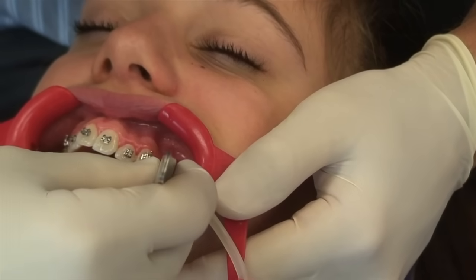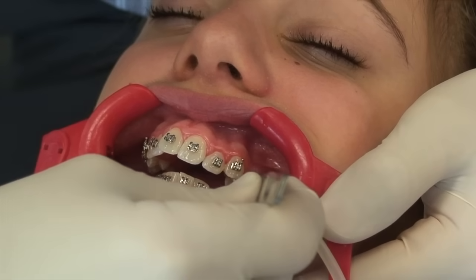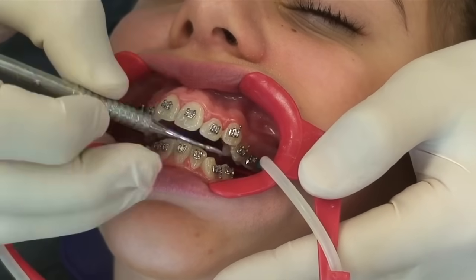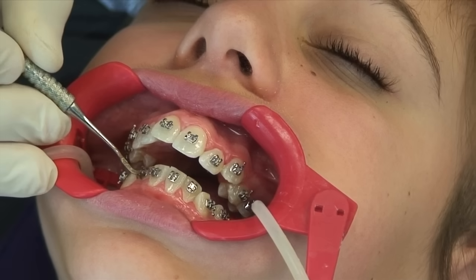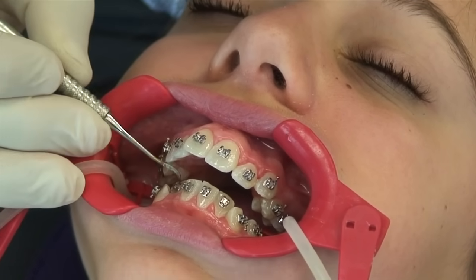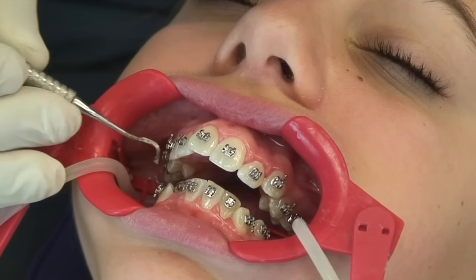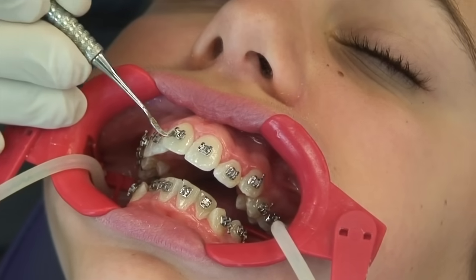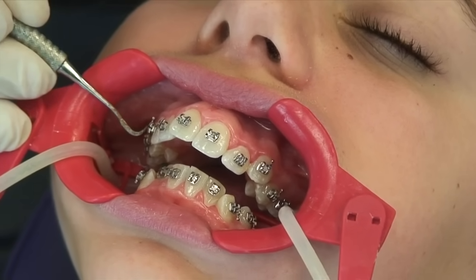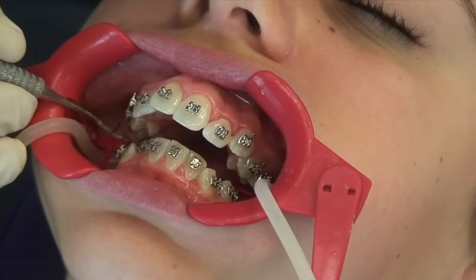So at this point, we have all the braces on the teeth. One of the things you might notice at this stage also is that each of the teeth has a very specific bracket for it. As a matter of fact, we use 6 different types of brackets on the upper arch and 5 different types of brackets on the lower arch. And they're a little bit different in shape and dimension. Some of them have hooks for rubber bands to wear, and you can see those hooks on the brackets themselves. And so they're all very specific for the individual tooth they're moving.